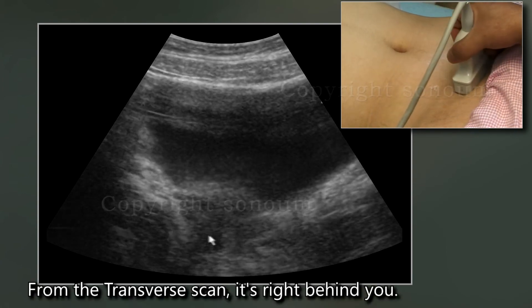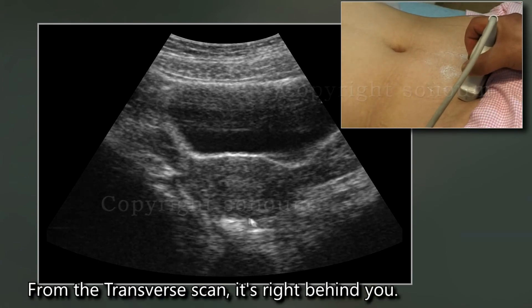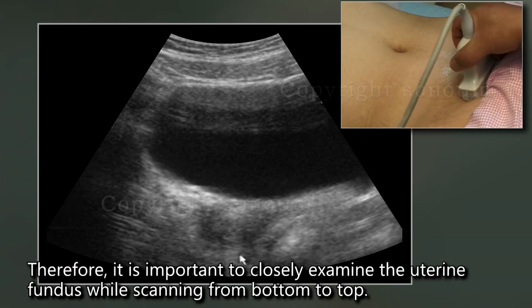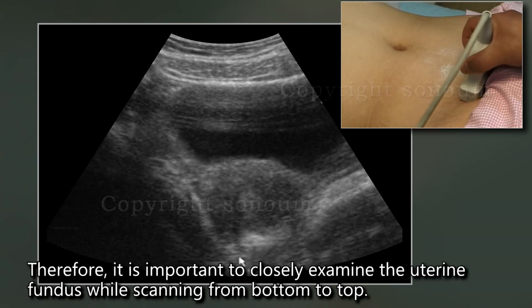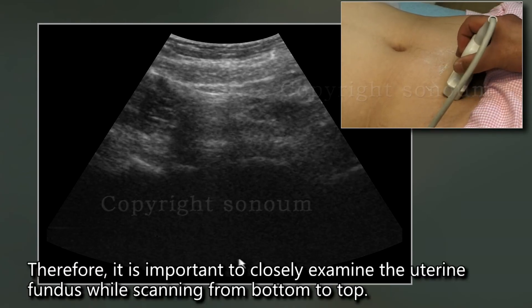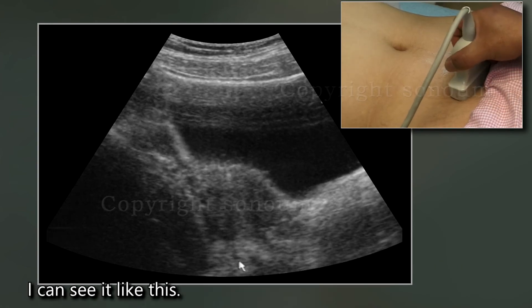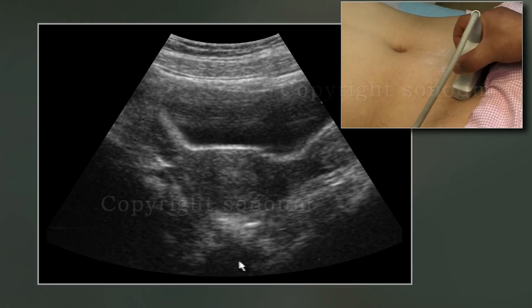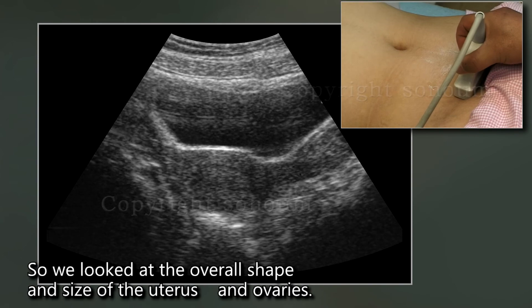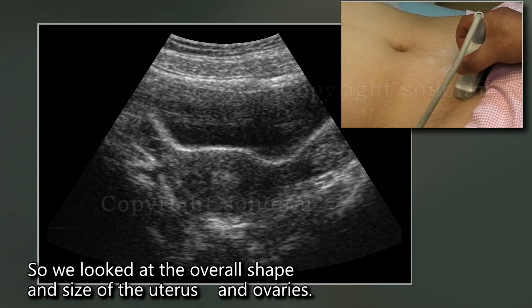From the transverse scan, it is right behind. Therefore, it is important to closely examine the uterine fundus while scanning from bottom to top. We have now looked at the overall shape and size of the uterus and ovaries.